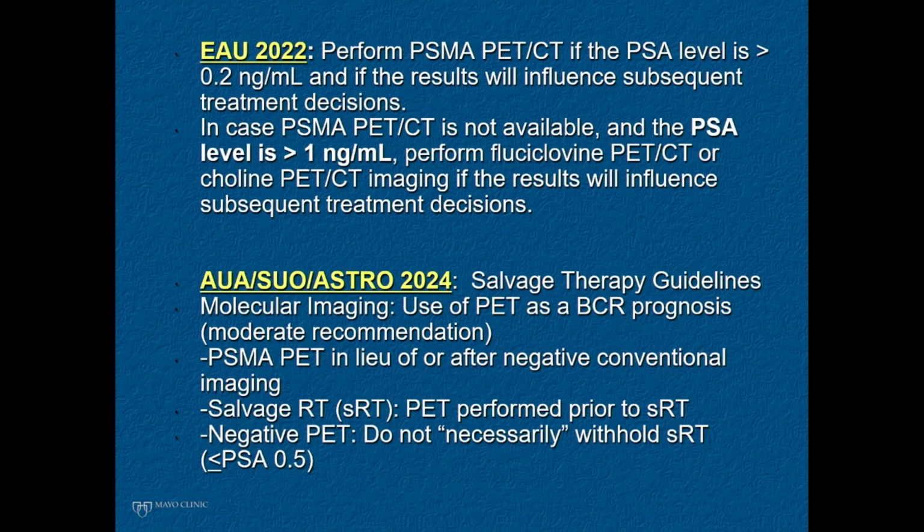So Dr. K went over this. I won't go over it. The prostate salvage therapy guidelines were just reported at this meeting a couple days ago. I will just reiterate that PSMA PET is now completely acceptable according to guidelines in lieu of conventional imaging or after negative conventional imaging. And there is a fairly strong statement that PET should be performed prior to salvage radiation therapy, which is now the gold standard in terms of postoperative radiation therapy compared to adjuvant therapy.